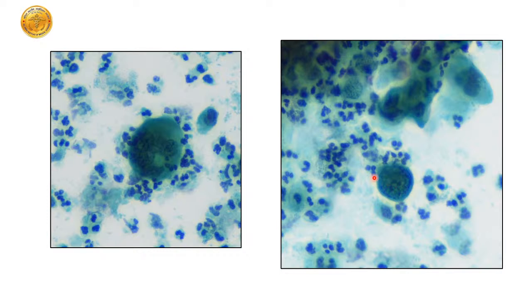Next slide. So another Papanicolaou stain smear to show you a bizarre multinucleated cell. It has about 6 to 7 nuclei, suspicious. Similar picture here. We called this high-grade urothelial cancer because of very abnormal looking cells, some of which were multinucleated, with high NC ratio.